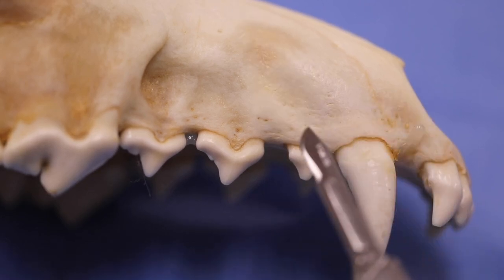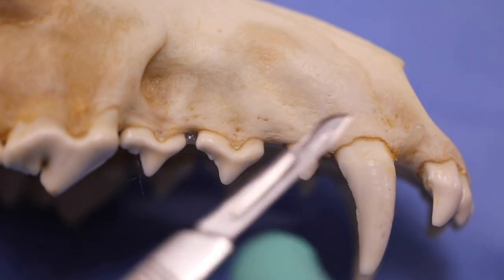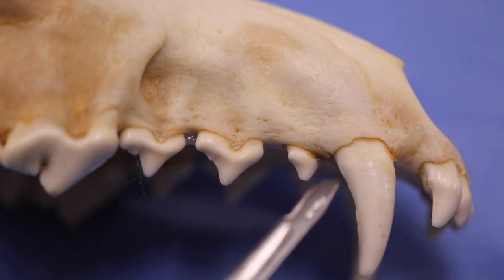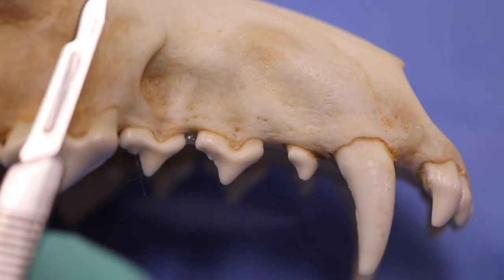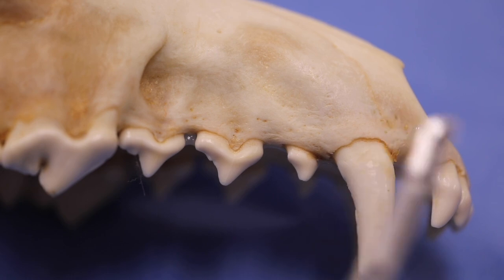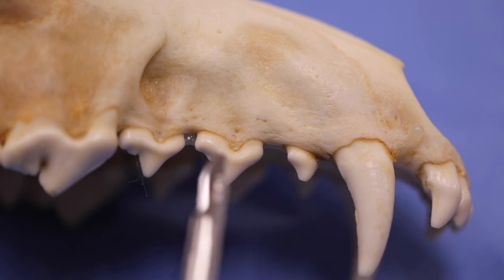When we're approaching incisions in dentistry for mucoperiosteal flaps, it's a lot different than it is in general practice for our normal incisions. Usually what we're doing is a continuous incision for, say, a laparotomy. It's more like this. And in dentistry, we've got this real thin mucoperiosteal flap that we're trying to elevate off of the bone, and in doing so, it's very easy to disrupt that. So what we want to do is use the scalpel in stab incisions instead of continuous incisions.